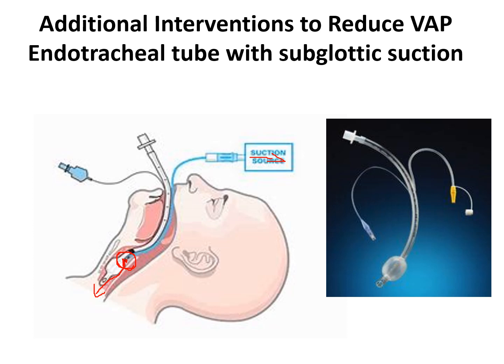And there are ways, if you don't have this special subglottic suction, within a thinner catheter that can go down and retrieve any secretions that are down there on the top of the cuff. So these are another way. Again, they're more expensive than the normal endotracheal tube, but they are available, and that does help reduce VAP.